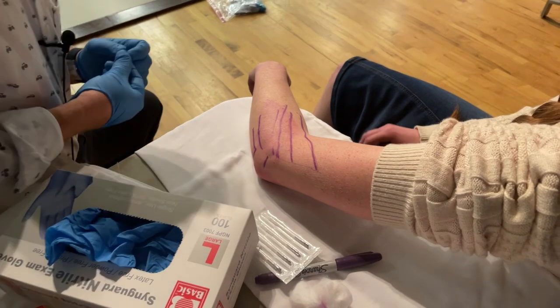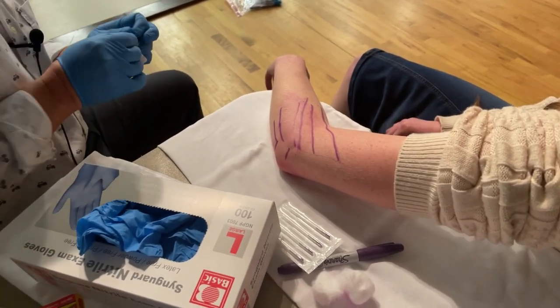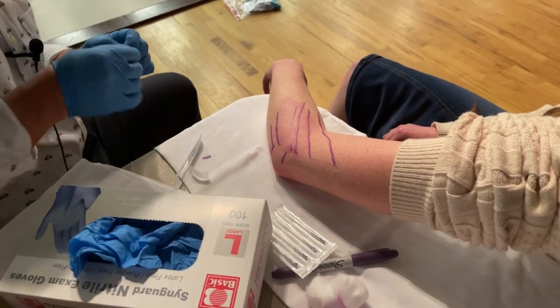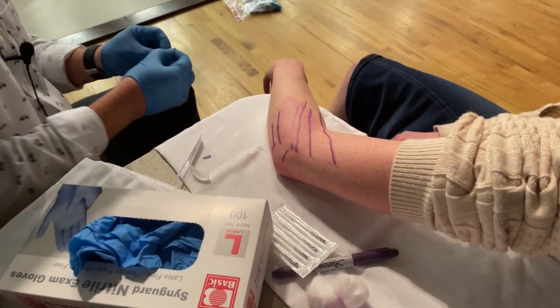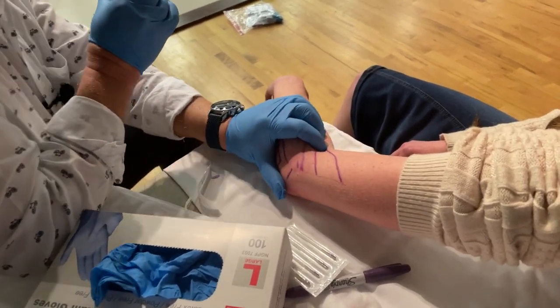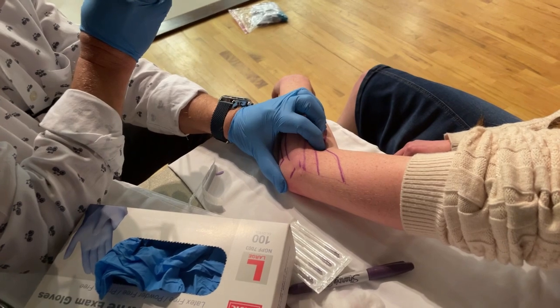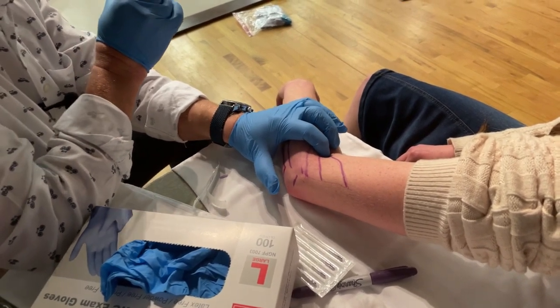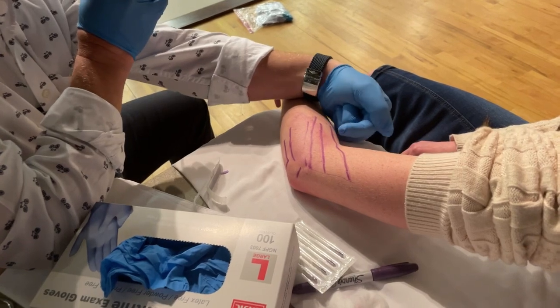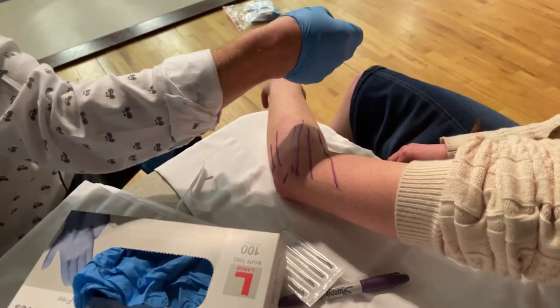How you doing, Katie? You feeling good? Nervous? You don't have to look. Is this the elbow that's been hurting? All right, where have you been hurting? So usually I'm going to spend some time palpating for trigger points, just feeling around at what might be the culprit. I feel a little taut band right there, and I can see that's on the brachioradialis.